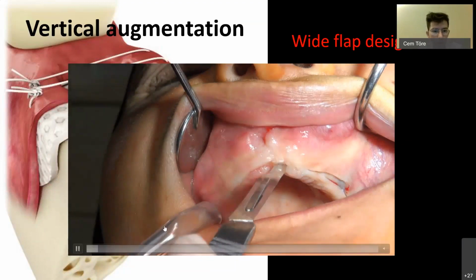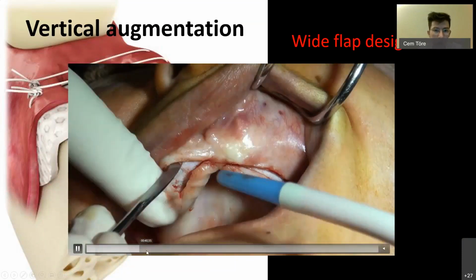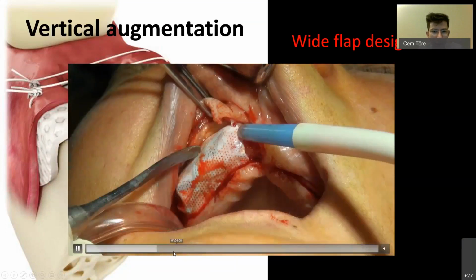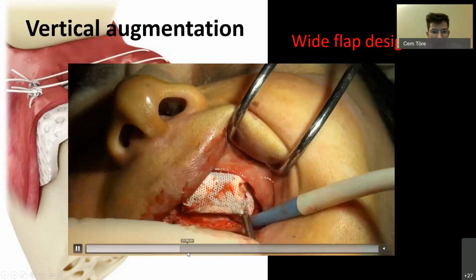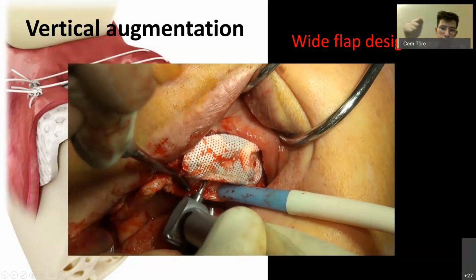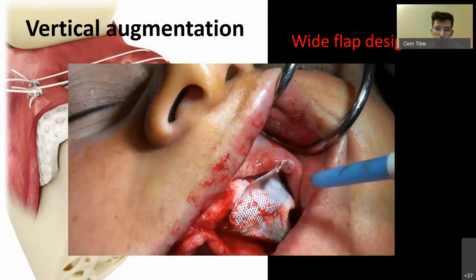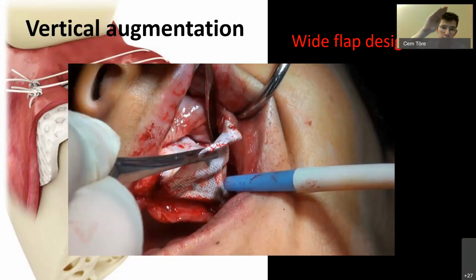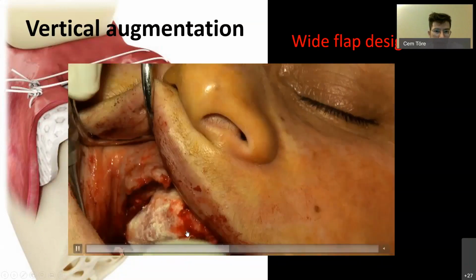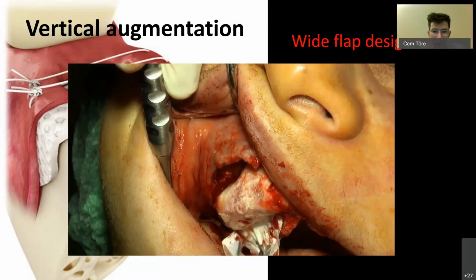Here we see the recovery video. We open the area. We are faced with the membranes, since they're not resorbable. They are there for the whole 9 months with the patient. We lift the flap, remove the screws and pins. You need to remove the screws, but the pins you can more or less gently remove by pulling on the membrane. If you have placed the pins on a very extreme edge, you don't need to elevate all the way. In the end, they look very pale, very white, but they quickly adjust as blood flows better to the area after we remove the tense membranes.